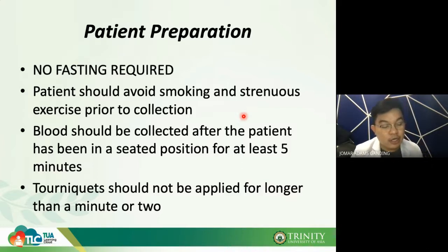Remember that the National Cholesterol Education Program or NCEP mentioned that the blood should be collected after the patient has been in a seated position or in a stable position, whether supine or sitting, for at least 5 minutes before specimen collection. So please remember that when it comes to posture. If you have not remembered that or if you have forgotten that, please make sure to review the pre-analytical, the patient preparation that was discussed in the lecture.